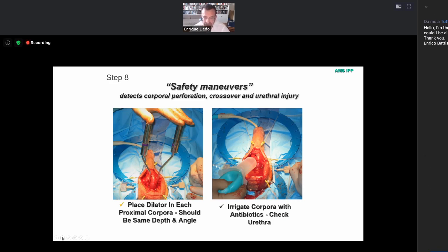The only thing that you have to do is to use the sides of the cylinder of the non-perforated side and put a spiral stitch in the tip of the extender, in the rear tip extender, and the stitch also in the albuginea. And you introduce the cylinder in the perforated side, and no problem. This is the solution to manage the patient with a proximal perforation of the corpus cavernosum. Don't get nervous, it's not difficult, and there is always a solution for every problem.